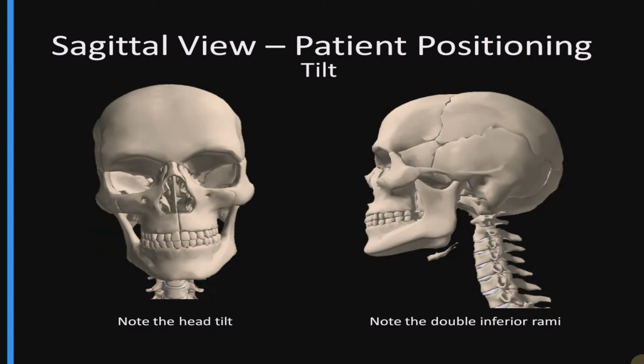When we accommodate for head tilt, we will be tilting the tube until the central ray is passing through the head tilt at the exact angle it is sitting. We'll be sure to review this process in the hands-on practical week 3.